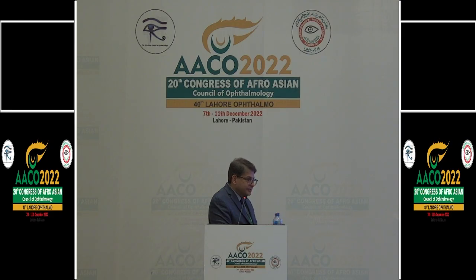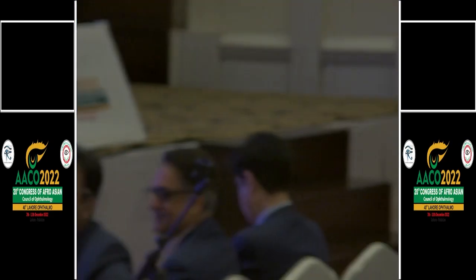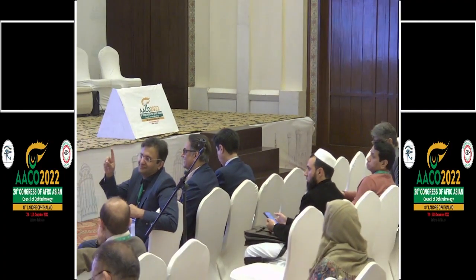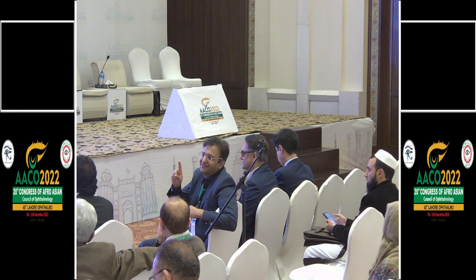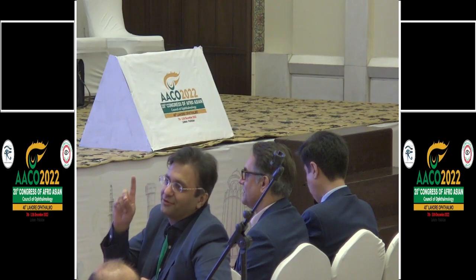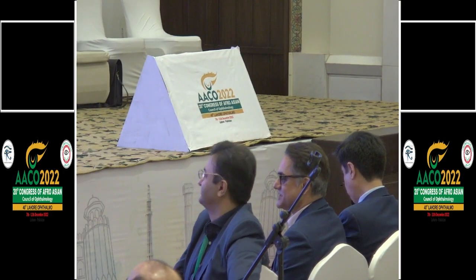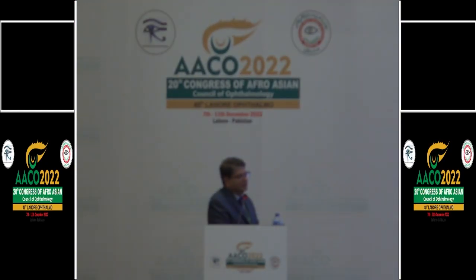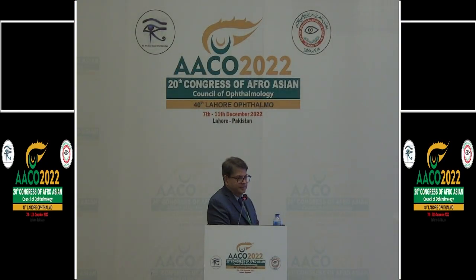Structure, no matter how advanced you get, fundus photograph is still invaluable. Please do not underestimate the importance of a good digital photograph. Yep. I think that's very good advice as a baseline for any patient coming in, right? Well, Rashid, let me say that fundus photography is not available in a lot of units in Karachi or Pakistan. What we advise is look at the disc.